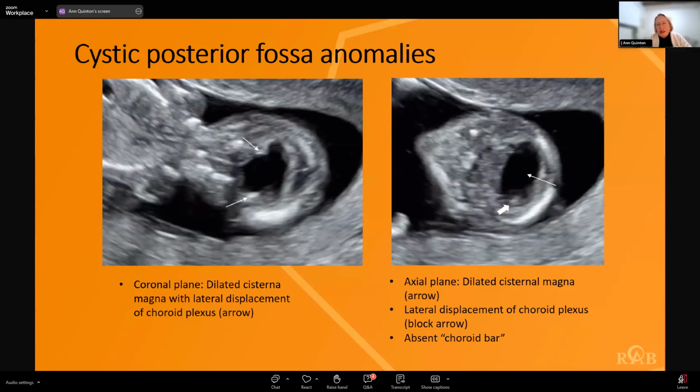That paper has only just come out and they have their formula in there. I guess, you work as an application specialist. Do you put the formula into the ultrasound machine and that can give you that information, or do you actually have to put the charts in? Yeah, you put the charts in.